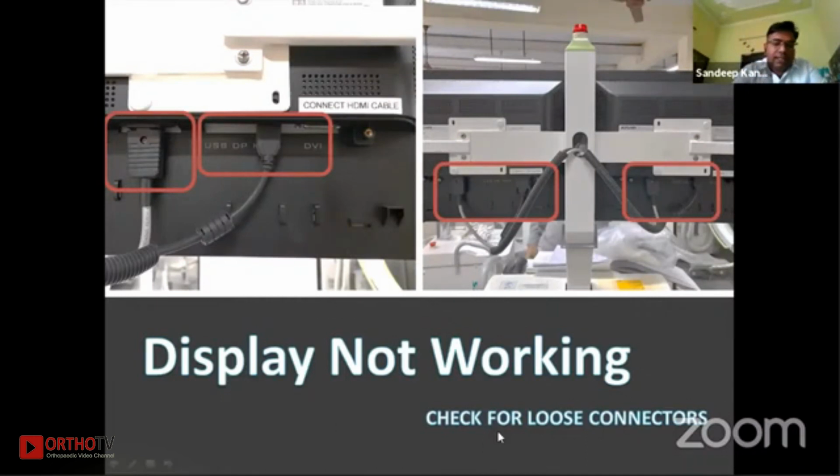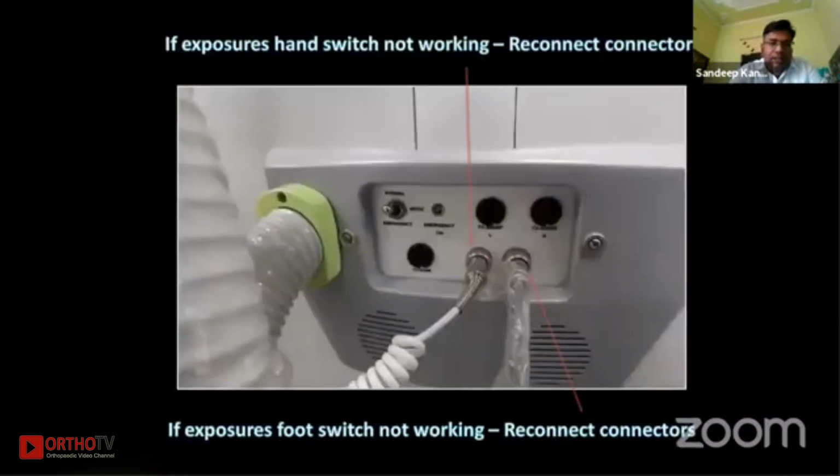So firstly we check whether it is a loose connector, then refix it. And third, sir, there are exposure hand switch related issues and exposure foot switch related issues. Both connectors are available on the machine, so reconnect them and try again.